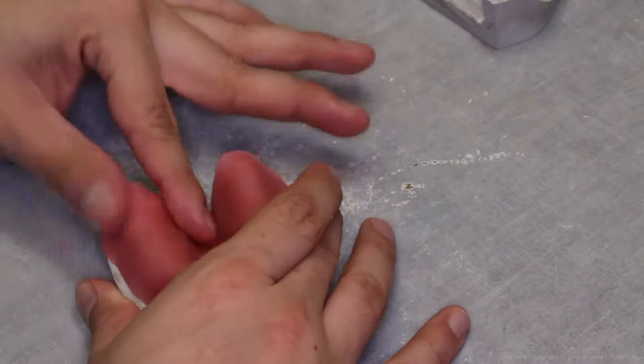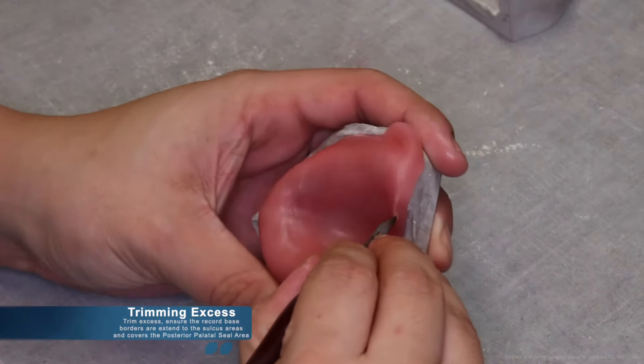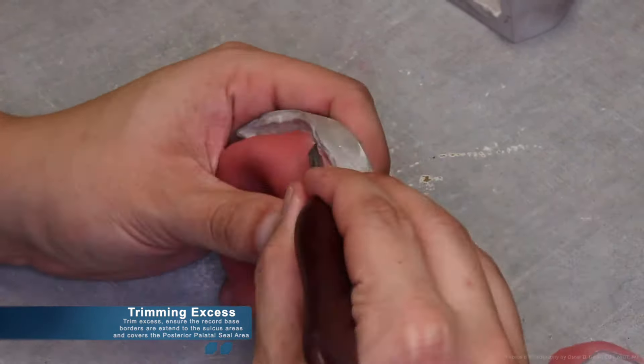Once the light-cure material is fully adapted, you may trim the excess. Ensure that the record base borders are extended fully into the sulcus areas and cover the posterior palatal seal area.